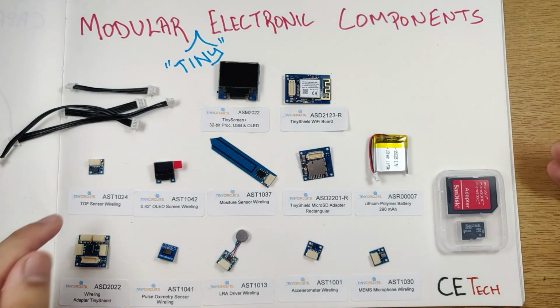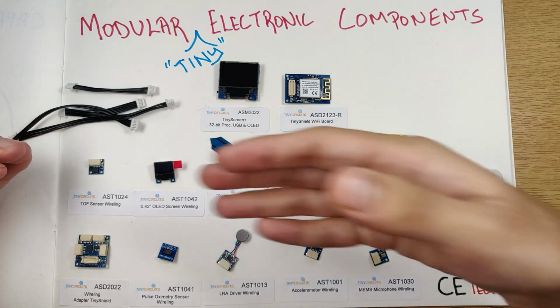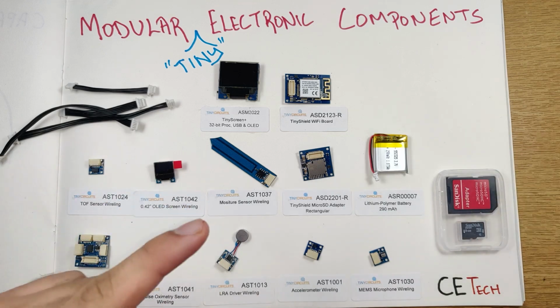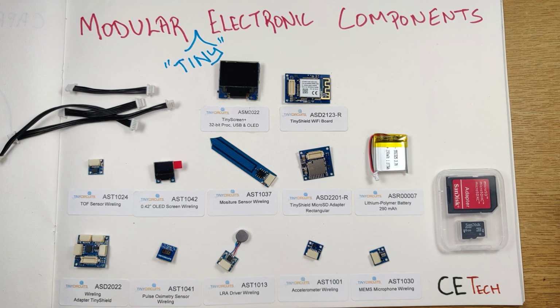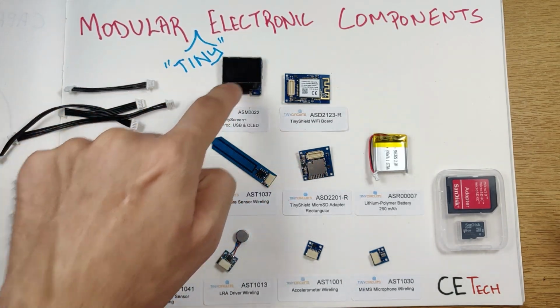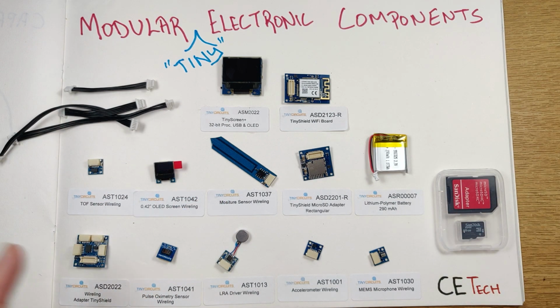These components come from a company called Tiny Circuits. We'll be taking a look at some of the components they offer and what projects we can make with them. And in today's video, we'll be making a fitness tracker in light of recent events. We have an oximeter over here. So what we'll be doing is using this oximeter to see our blood oxygen and heart rate levels on a display. And if you're interested in something like that, stay tuned to this video.